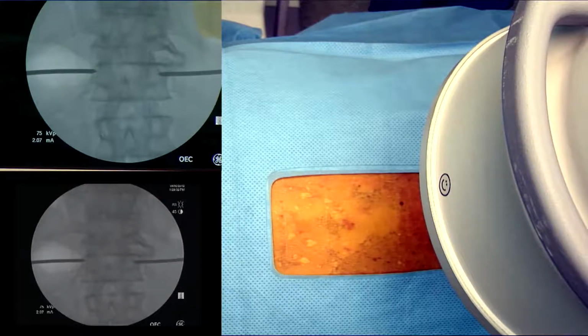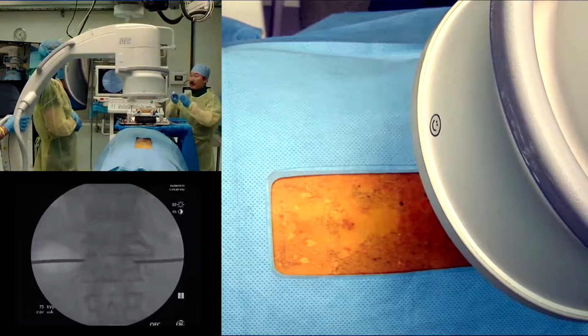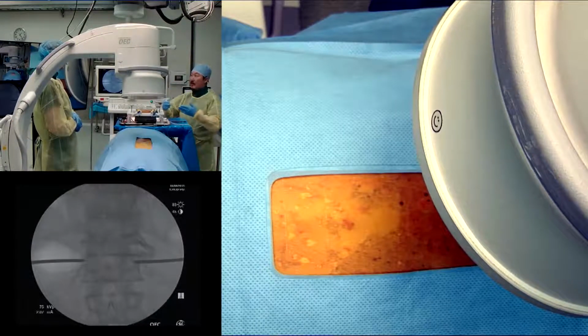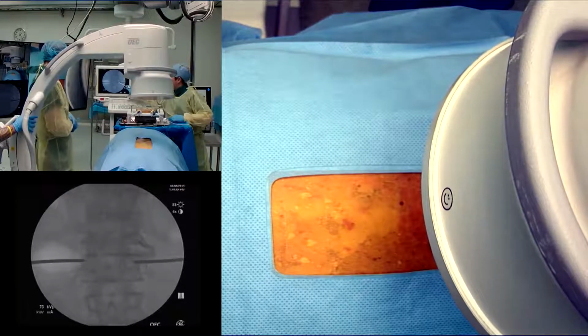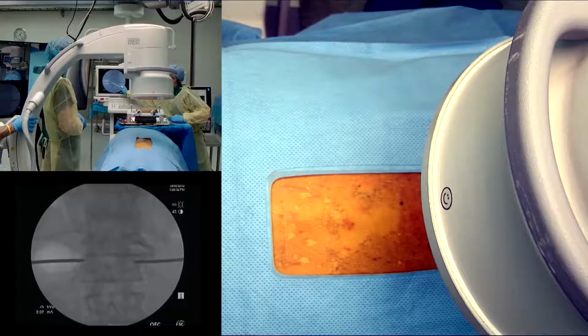The thoracic spine is a little bit different because, as you know, the thoracic pedicles end up going more from cranial to caudal, and it's much more in the sagittal plane. So most of the thoracic pedicles are more in the mid-sagittal plane, and as you go from upper lumbar to lower lumbar, it goes from more sagittal to more of a coronal orientation. So in the thoracic spine, we're going to go a little bit more in the 2 o'clock position on the right and more on the 10 o'clock position on the left, and aim from cranial to caudal.